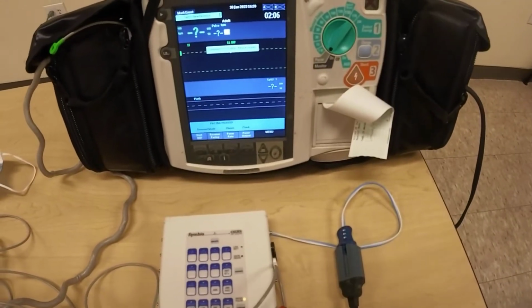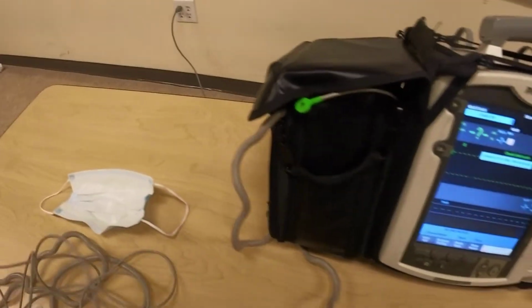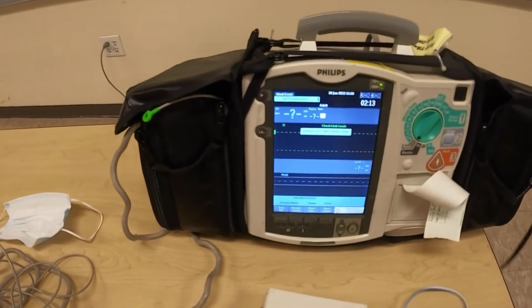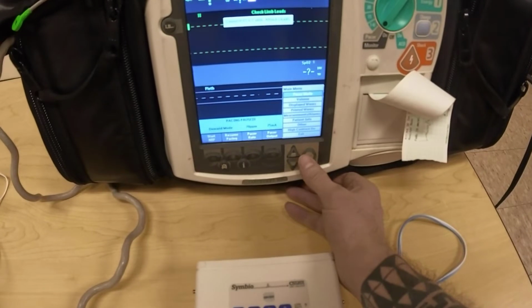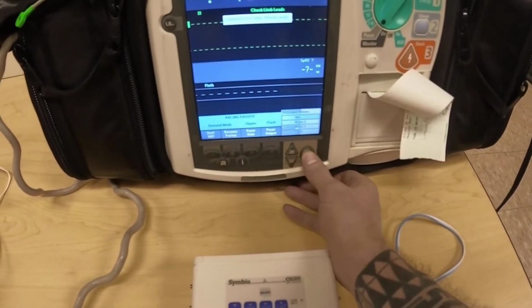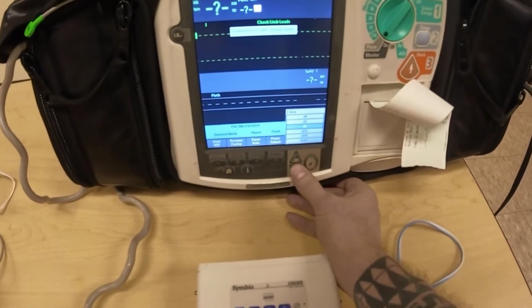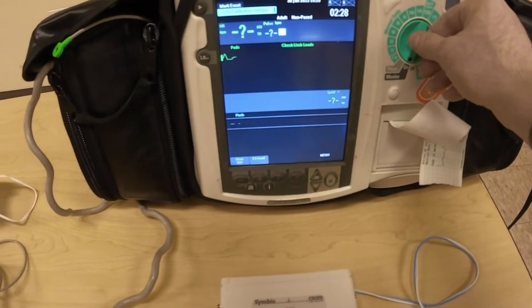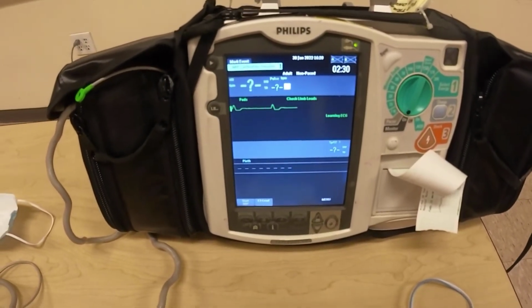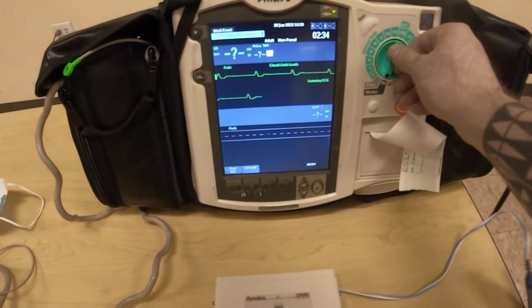So now let's see what happens. Let me disconnect all these limb leads. I only have my pads connected. I'm going to switch the displayed waves to be the pads. So let me turn this off. From the pacer, we're going to go to the pads. So pads are displayed. This is all I have connected. Third-degree heart block again.